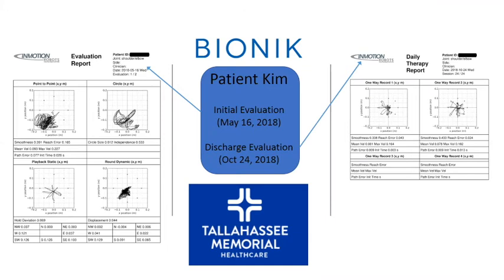The cool thing for her is that in the daily therapy report on the right-hand side of the screen, you can now see that she's starting from the center point, which is an accomplishment in and of itself, in that she's now able to position her arm and start from that point.